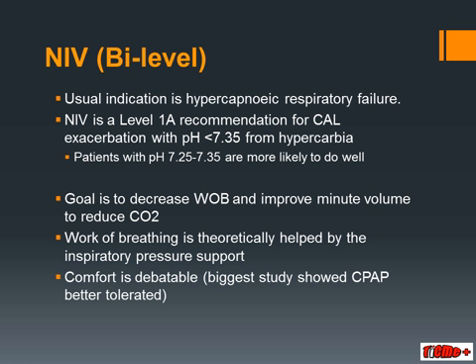It's a common belief that bi-level ventilation is better tolerated than CPAP. However, a huge study on both of these modes in acute pulmonary edema seemed to indicate that CPAP was better tolerated. The reason for this appears to be that patients don't like the pressure. CPAP confers a lower mean airway pressure than bi-level does and is thus likely to be better tolerated.